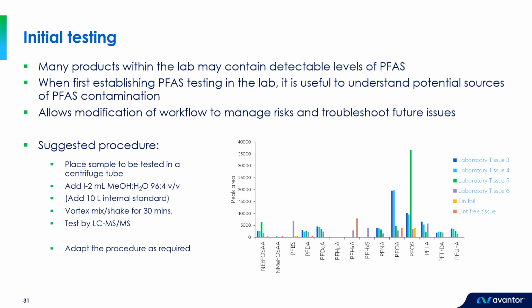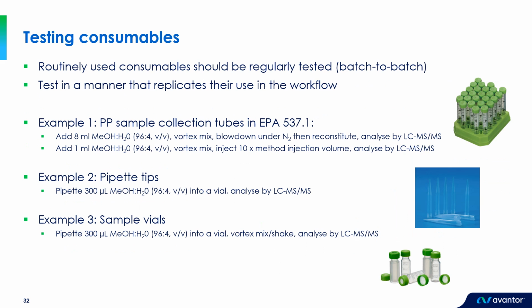So these are obviously all potential sources of extractable PFAS that, if we're not careful, could contaminate the environment we work in or our samples if they come into contact with them. Whilst it's not easy to necessarily eliminate those materials from the lab, we can certainly look to restrict or control their use to minimize the risks. It's absolutely essential that any consumable products that come into contact with our samples are free of detectable PFAS, as they will, of course, immediately contaminate our samples.